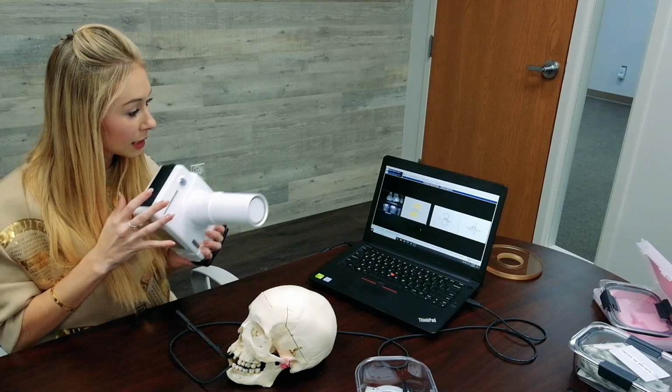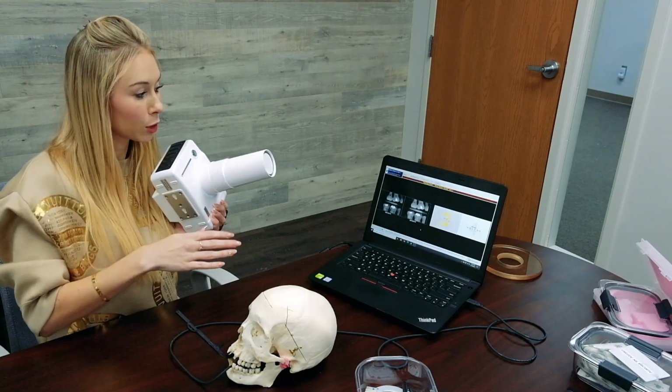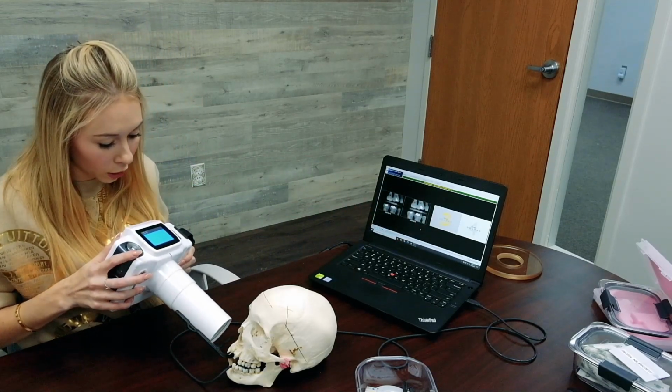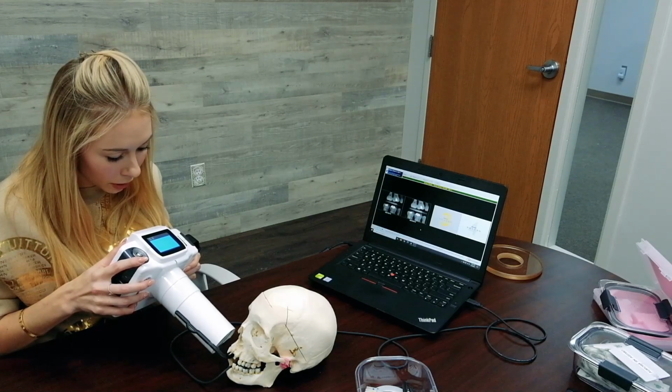Here, and what's really great is the tooth numbers are already pre-labeled within the layout on X-ray vision, as you guys can see here, which is quite nice. And I'm going to go ahead and take his third image for his bite wing.